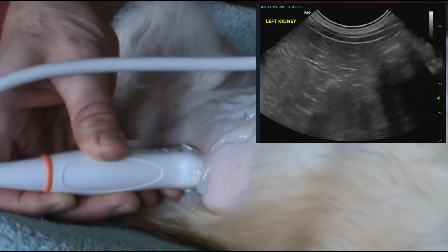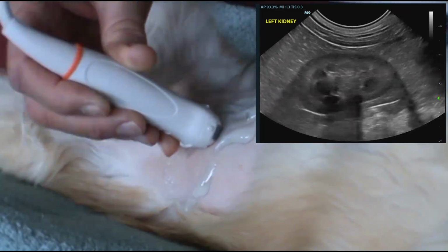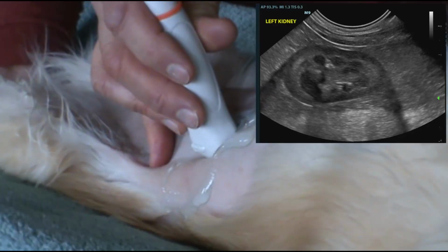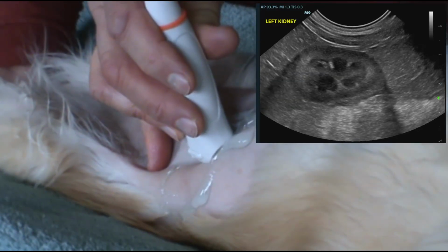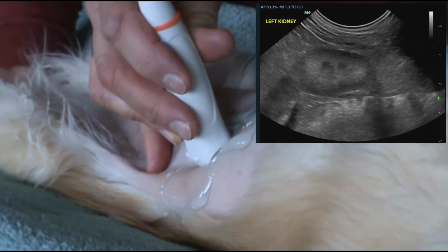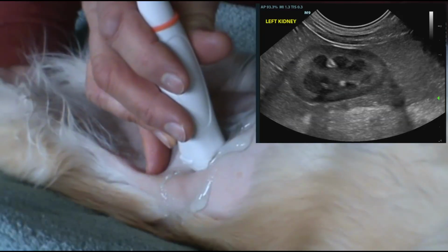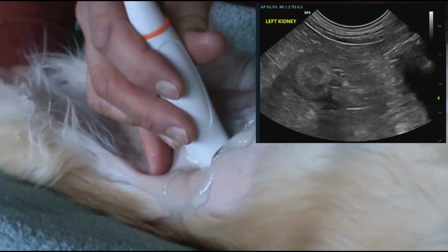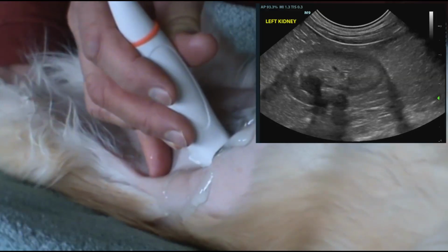In some cases, it may be easier to view the kidneys from a left ventral sagittal transducer position. The kidneys cannot be bisected from this position, and the appearance is different. It may be more difficult to recognize a dilated renal pelvis.